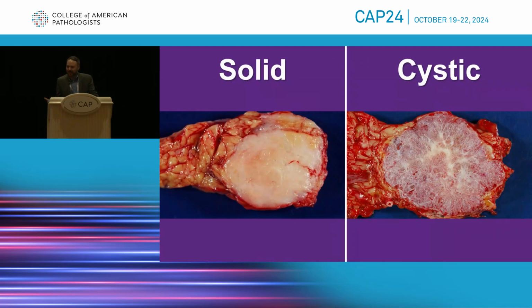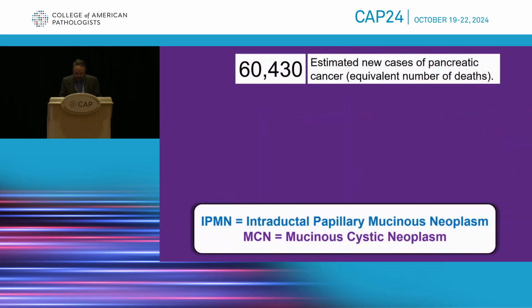Artur covered a lot of the solid lesions, which are very exciting, a lot of neuroendocrine stuff there. For cystic lesions, I'm a cytologist, so people get fluid, they send it to us. I like to look at cells, but then I get fluids, so sometimes there are cells in the fluid, and that's great. So how do we deal with these cystic lesions on FNA?